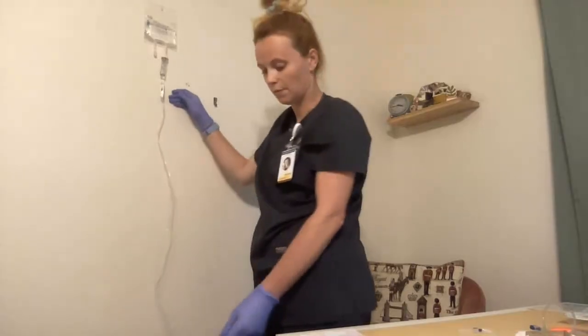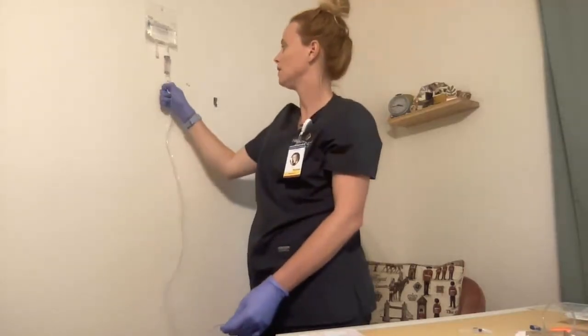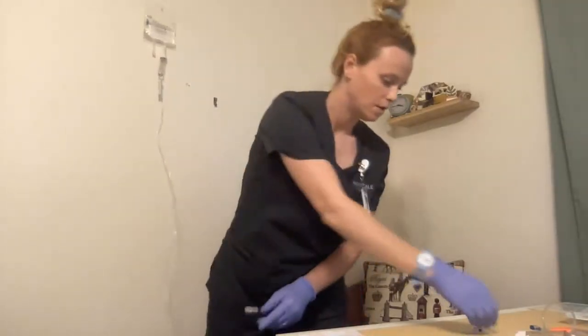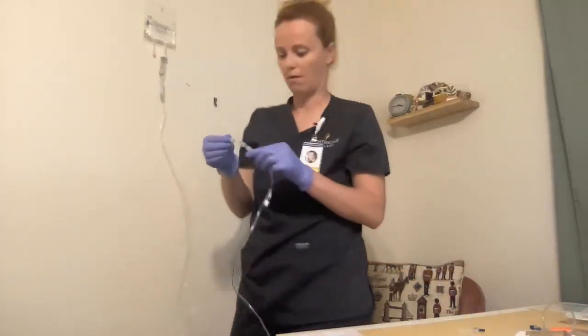I have counted for a full minute. I'm going to clamp this off and put the cap back on.